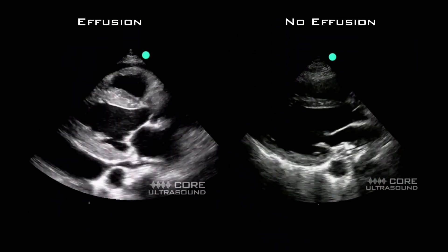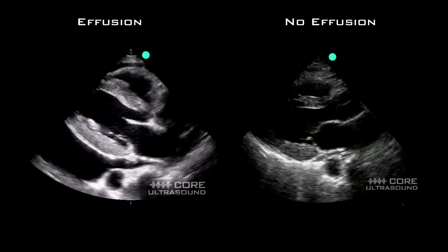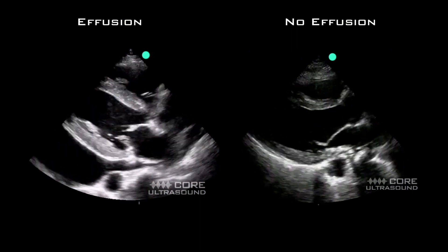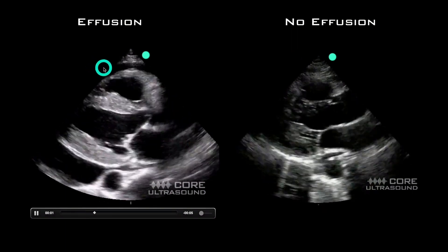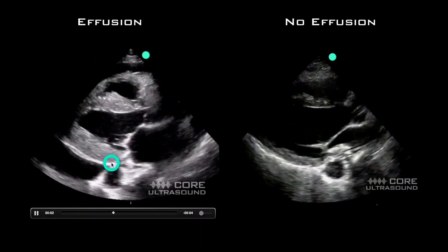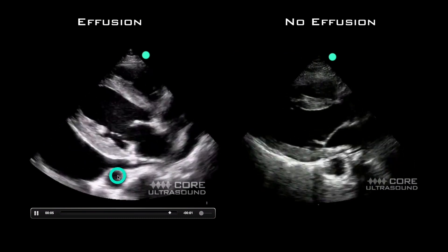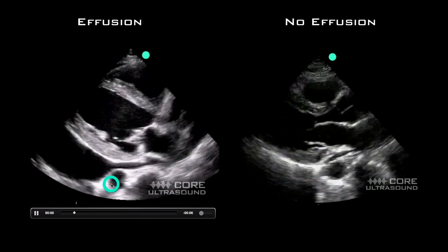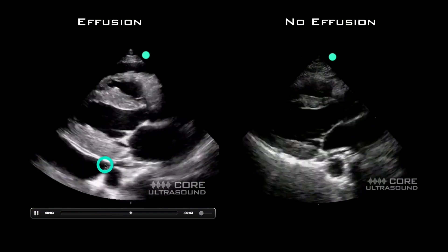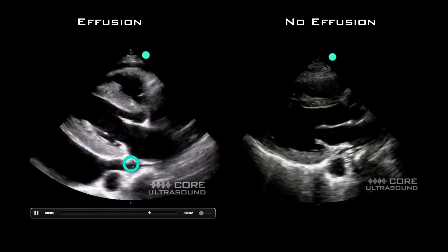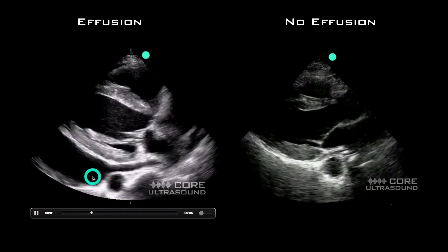This is a parasternal long axis view of the heart, and this one is nice because sometimes if you're not sure whether something is a pericardial effusion or a pleural effusion, you can use this view to help tell the difference. The key is the descending aorta: if the fluid you think is a pericardial effusion is seen going anterior to the descending aorta, it is a pericardial effusion.